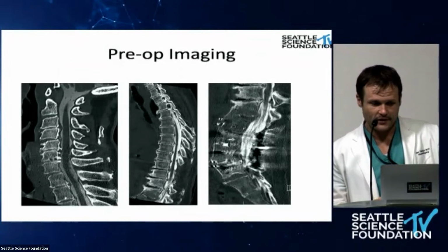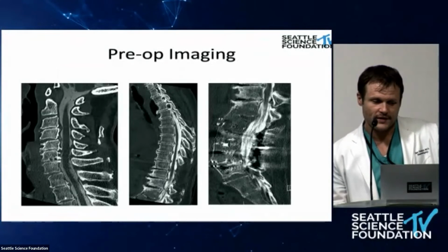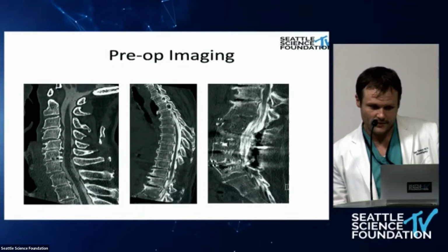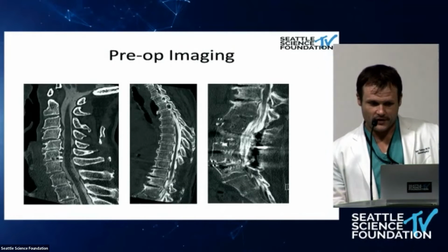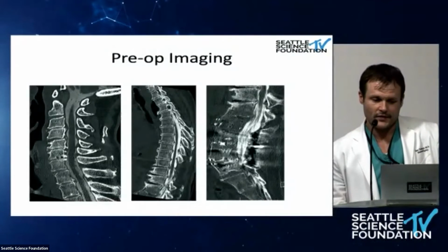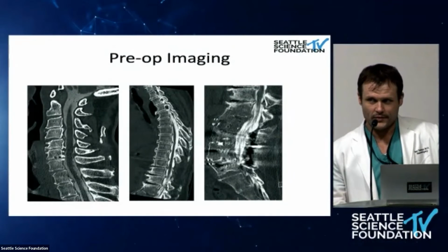This is a CT myelogram of her entire spine. It shows her laminectomy site from T9 to T11 in the middle sagittal slice, and the kyphotic deformity associated with that. And then her lumbar spine, which shows robust fusion from L2 to L5 and autofusion from L1 to L2, and numerous areas of stenosis and foraminal stenosis.